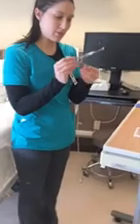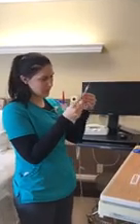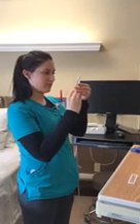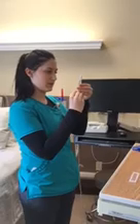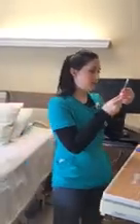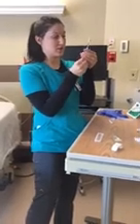I'm going to dispose of this so I don't need it anymore there. Okay. I'm going to go ahead and shake this out so that that air bubble moves to the top. It's taking its time. Okay. I'm just going to go ahead and push that up there. And then I'm going to go ahead and draw out my 0.2 milliliters of air.